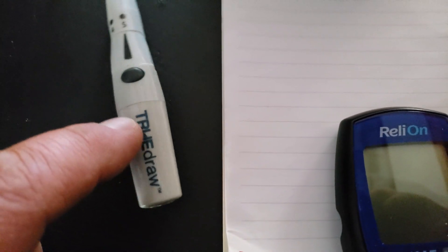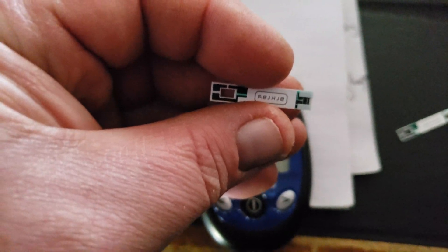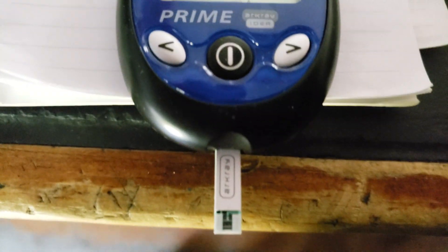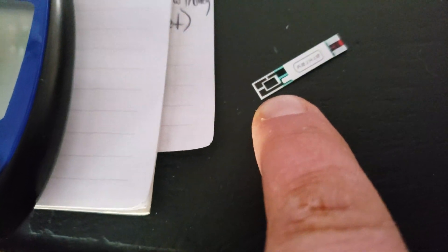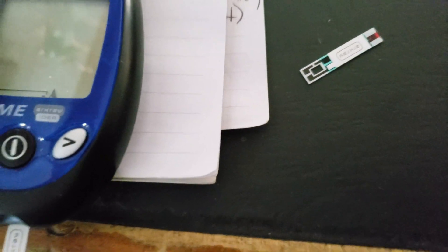Once you have loaded your Lancet and are ready to do the testing, you simply take a new test strip out. Now, this is impossible because I'm not a professional YouTuber. You take your brand new test strip out and place it into the receptacle. This end here goes into it. That end is your blood end, we'll call it.